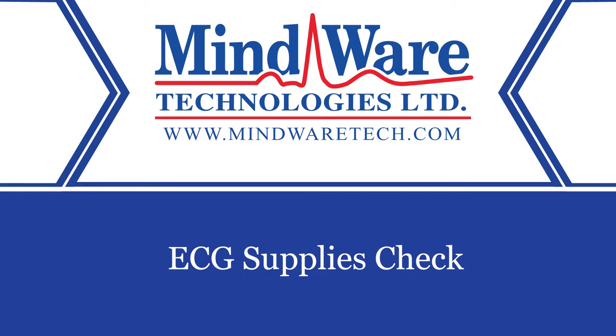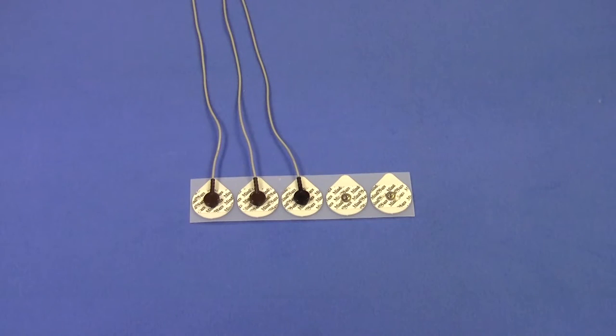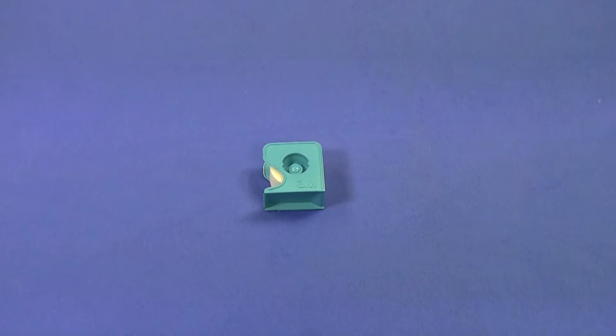First, let's take inventory of the necessary supplies for collecting ECG. To collect ECG we need three ECG medical sensors or electrodes with lead wires attached, alcohol prep pads, and micropore tape.